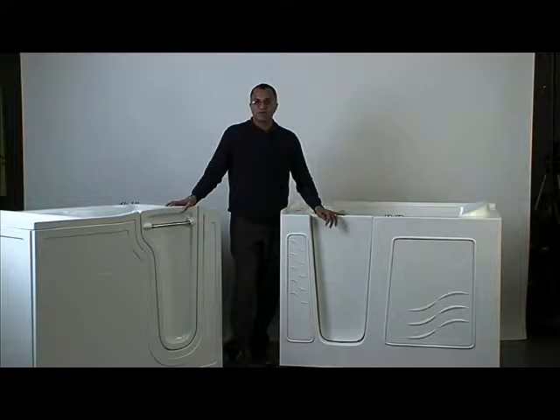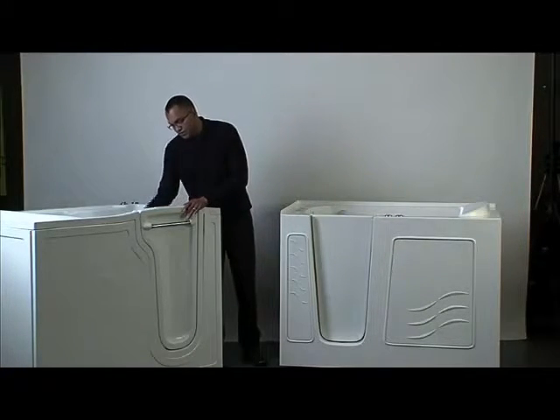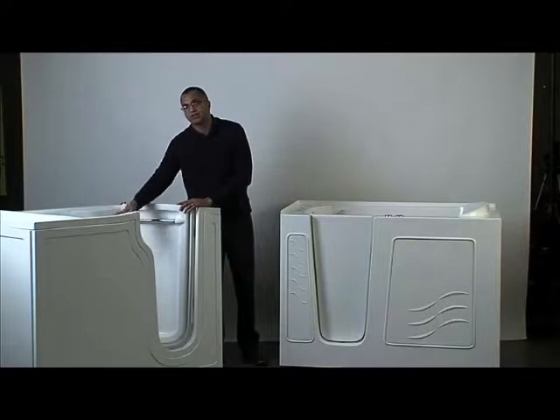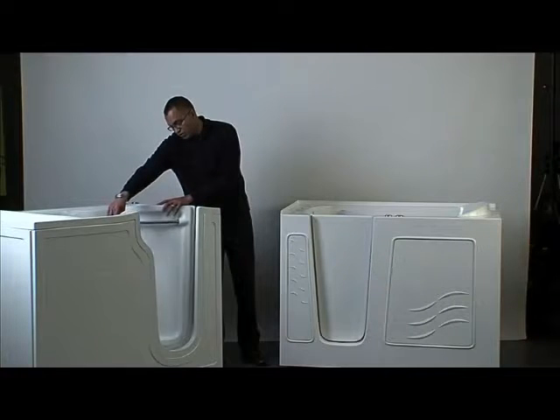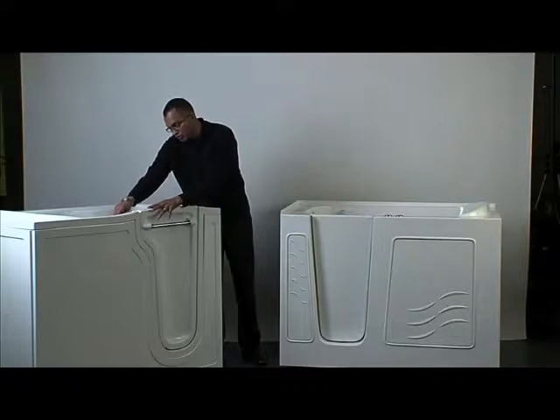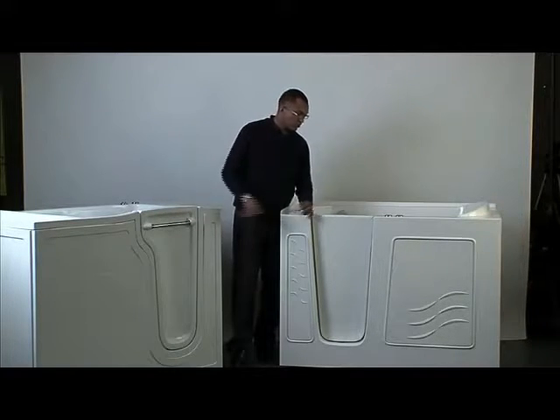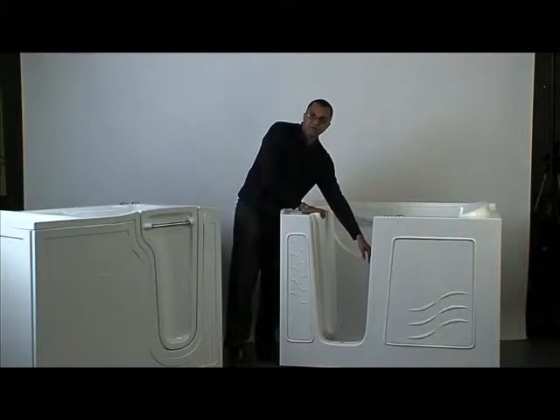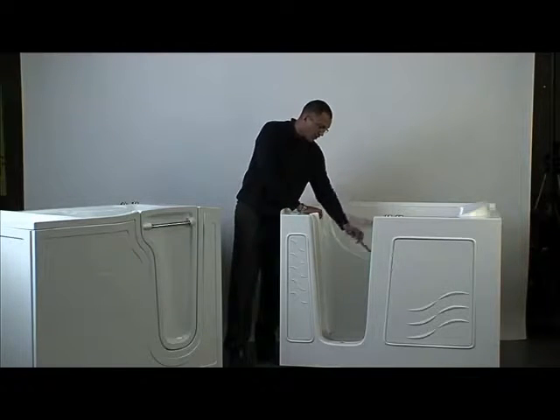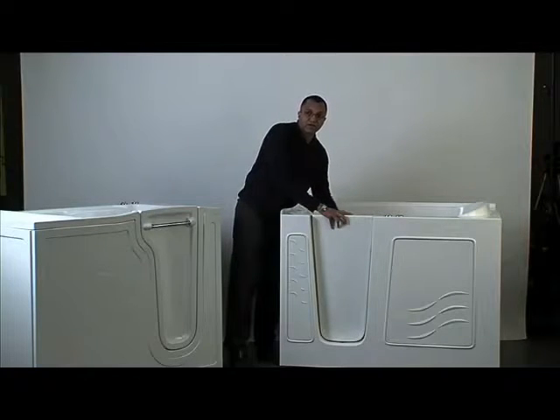Now let's talk about the locking mechanisms. With the Restore, our handle has a dual-point locking mechanism — two cams — so both the top and the bottom of the door are firmly locked in place. Not so with the Meditub: there's a single-point locking mechanism. That is also the same case with the Safety Tub and American Standard — just one single locking mechanism.